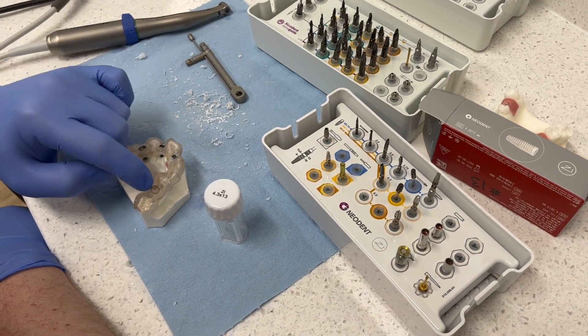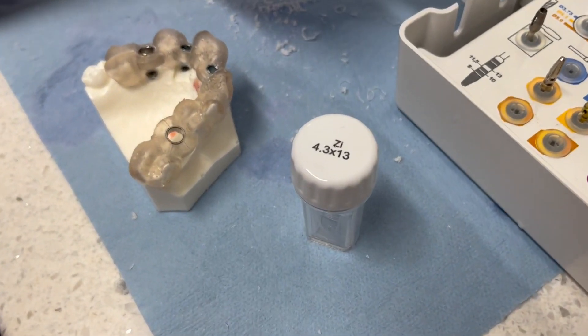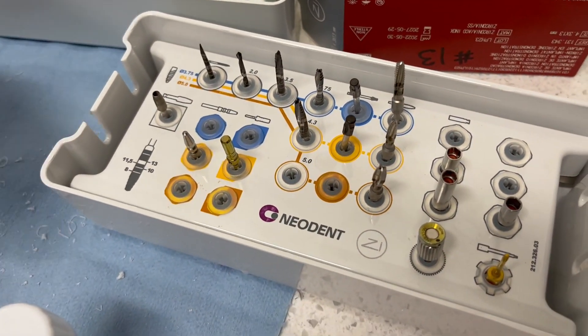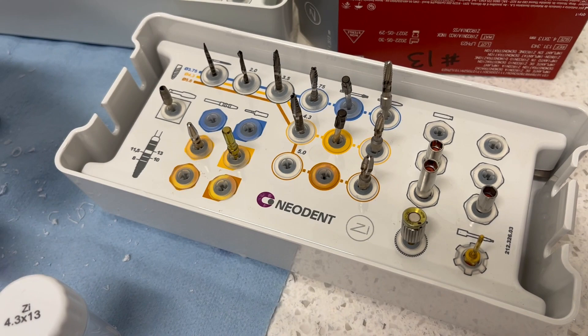We're going to do a ZI in number 13. So if we look at the ZI kit, we're going to be a little bit different than we are for our normal GM kit. So this model is going to be mimicking more of a D1, D2 type bone.